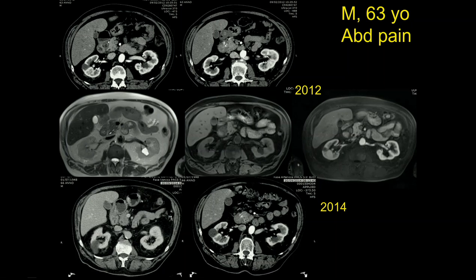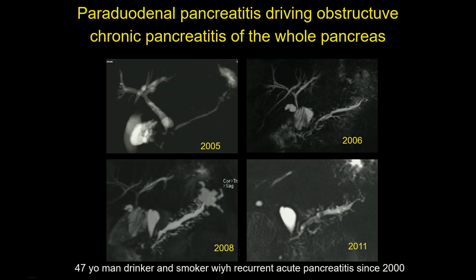These lesions can show calcification. In older patients, follow-up confirms this as a benign lesion located within the duodenum and pancreas. In the early phase of the disease, when the pancreas is unaffected, the pancreas shows normal signal intensity while the lesion is hypointense. You can see a sharp margin between the pancreas and this lesion. A pancreatic cancer in the groove area usually has infiltrating margins — when you see sharp margins, think about paraduodenal pancreatitis. If untreated, the lesion will eventually lead to chronic obstructive pancreatitis due to pancreatic outflow impairment.